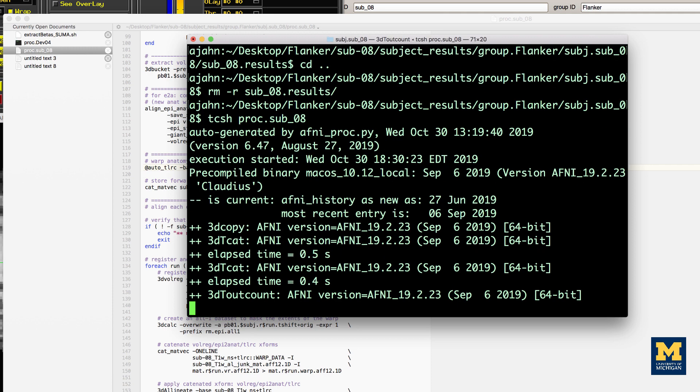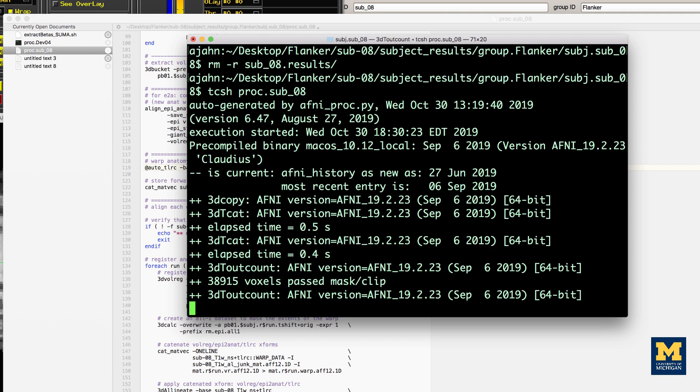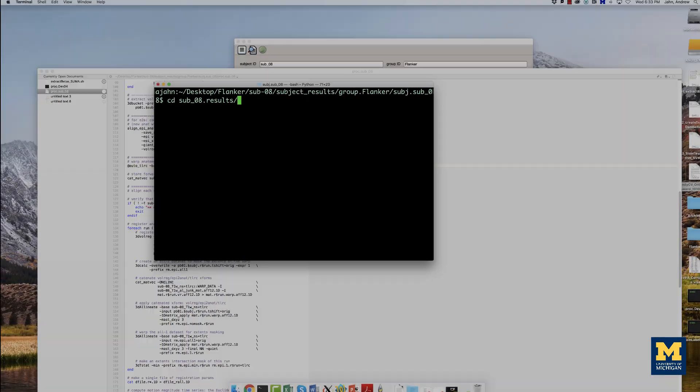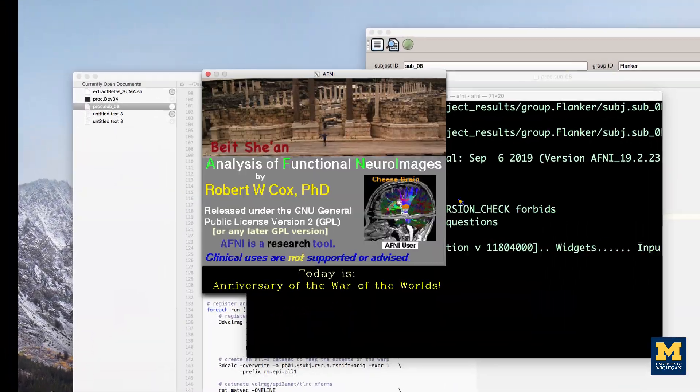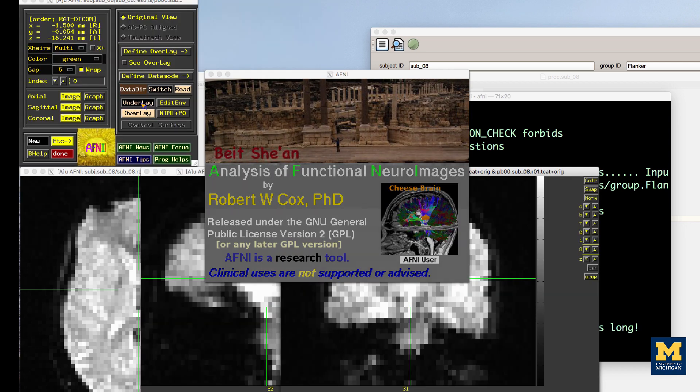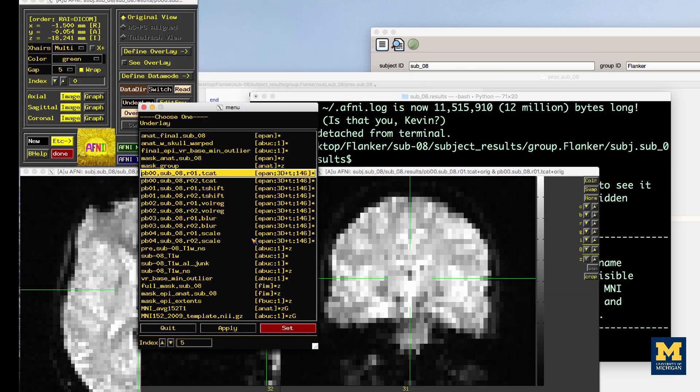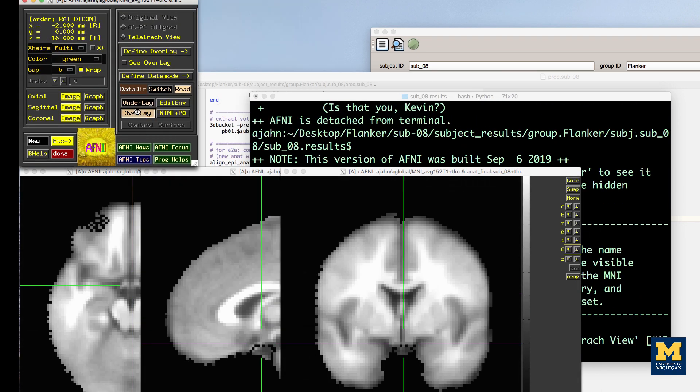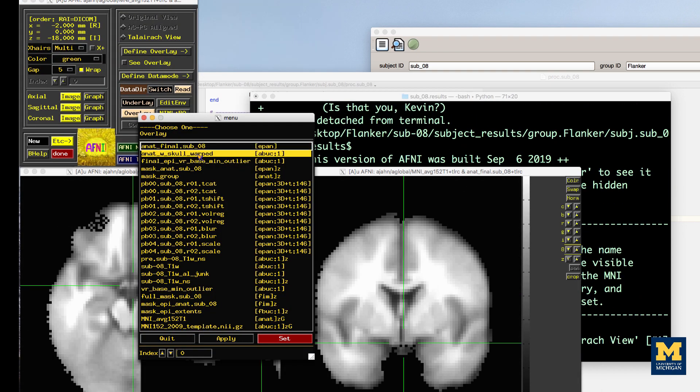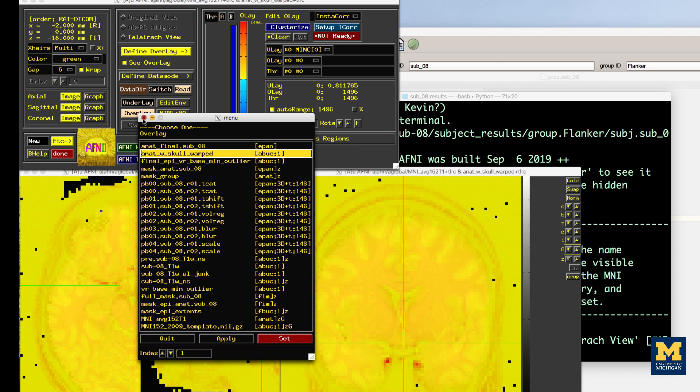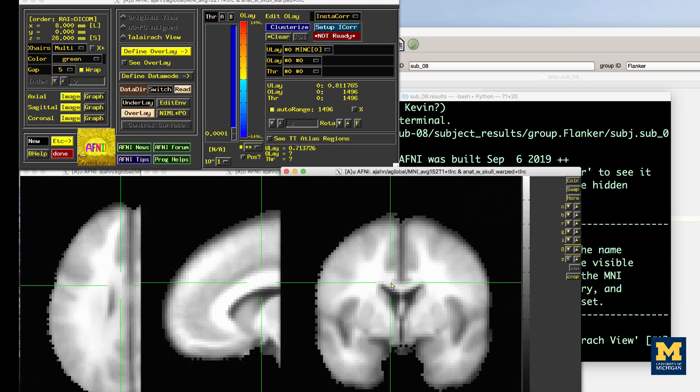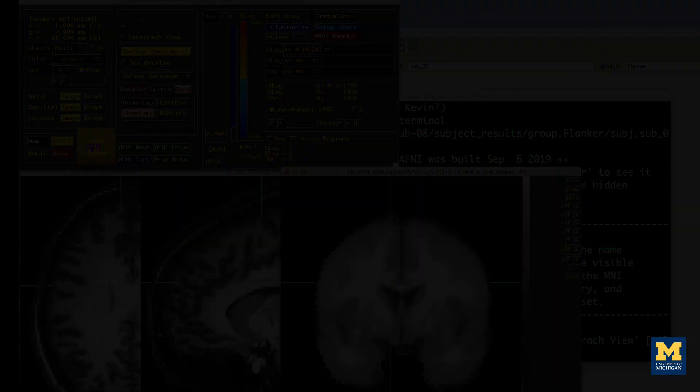As before, wait a few minutes for it to finish, and then navigate into the preprocessing directory, and load the same set of images as before. You should now see that the problem is fixed.